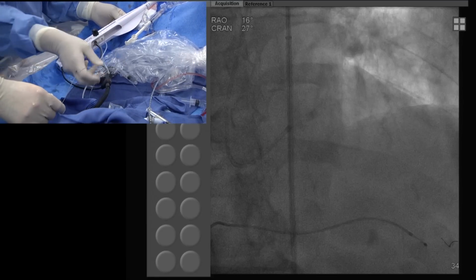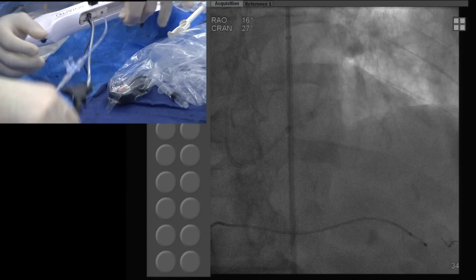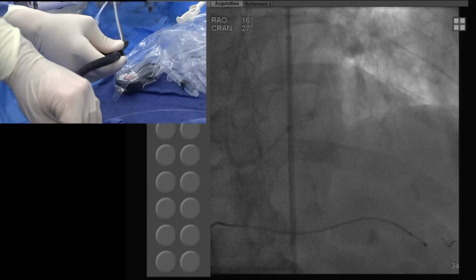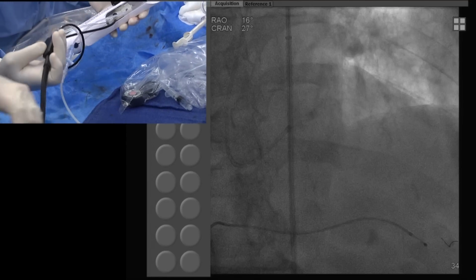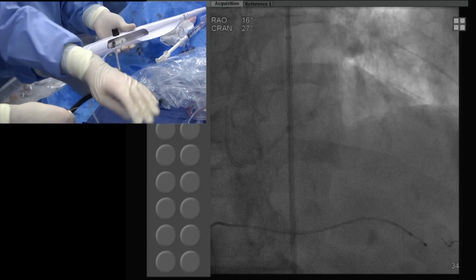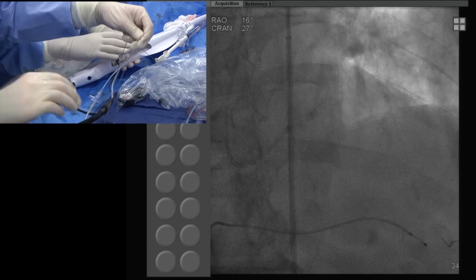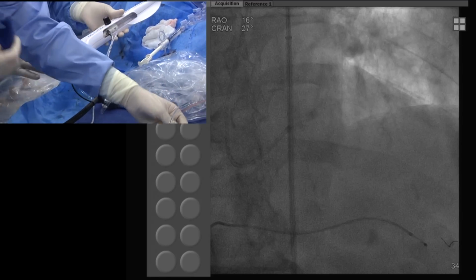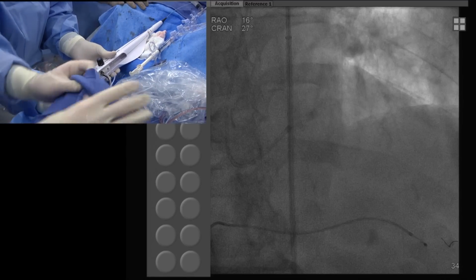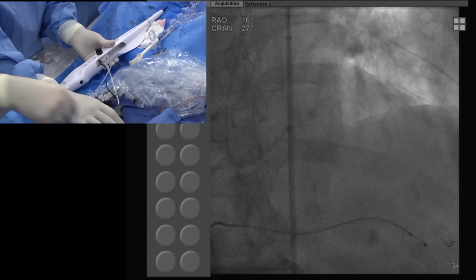Make sure, once it comes out of the basket or the box, that you straighten the cable, because the angulated cable is the one that continues to give trouble. You have to keep it straight, and they are changing this because it's still too close. Many times it just pushes the whole advancer down. So once you have straightened it, some people even put a clip if necessary, but keep it straight.